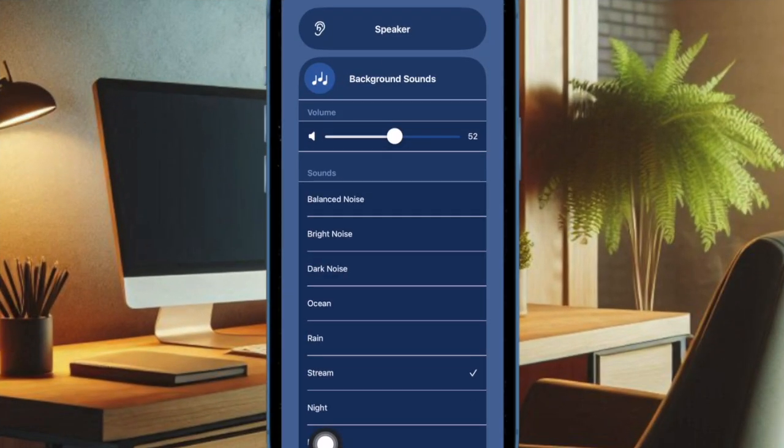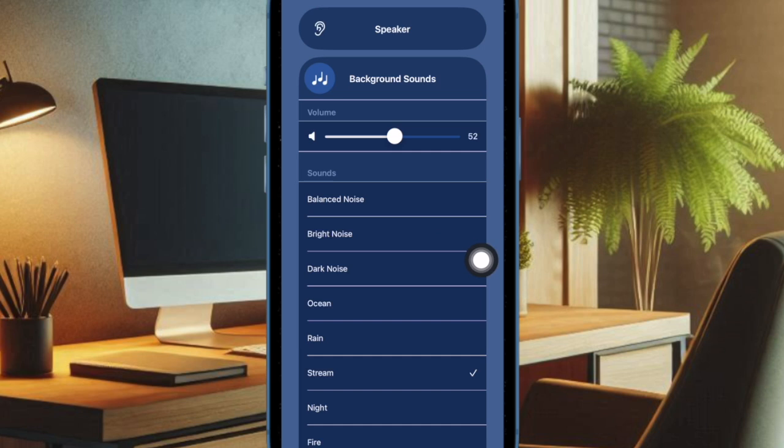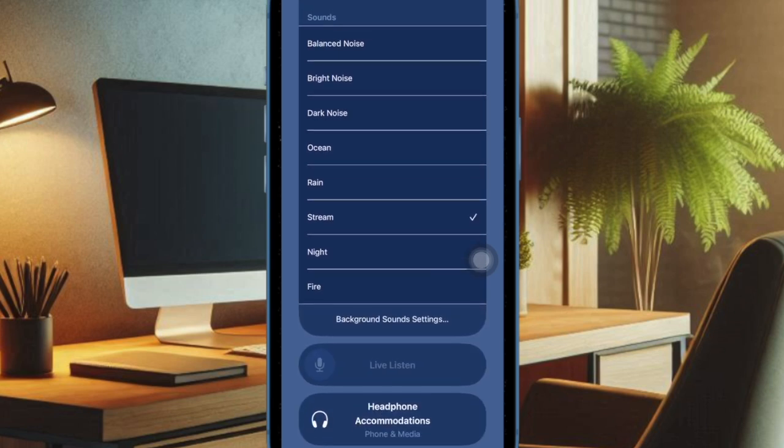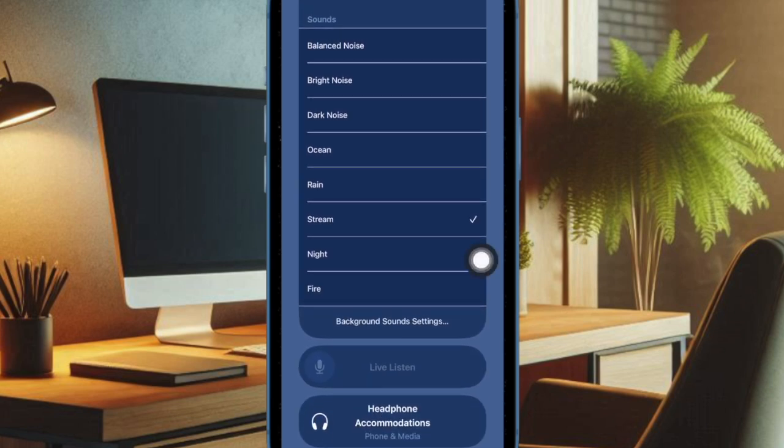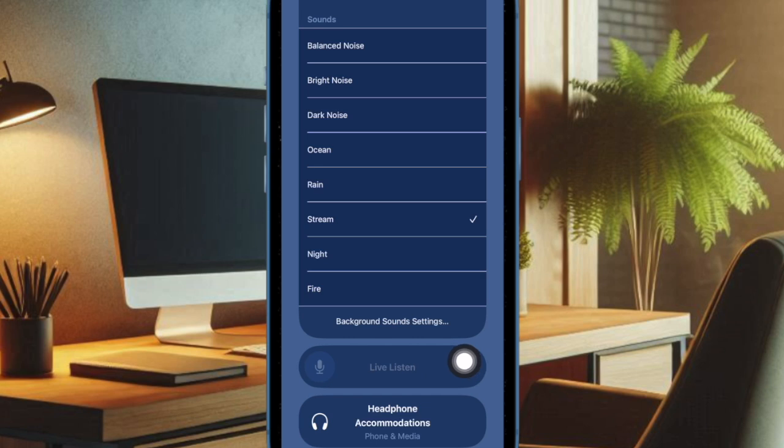Now you can access and use your favorite hearing features such as Live Listen, Headphone Accommodations, Background Sounds, and more. It's worth pointing out that if you're using AirPods Pro or AirPods Max, you can adjust all your settings like Transparency Mode or Noise Cancellation directly from the hearing menu.